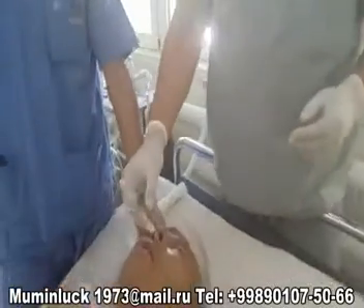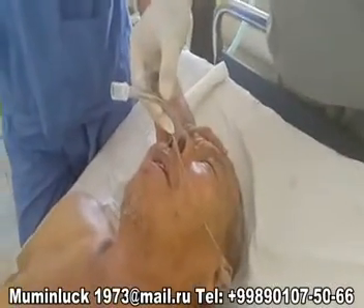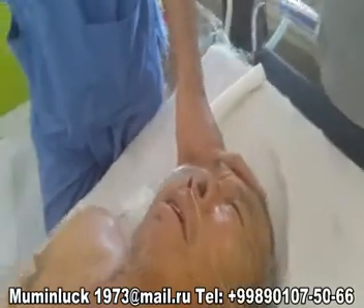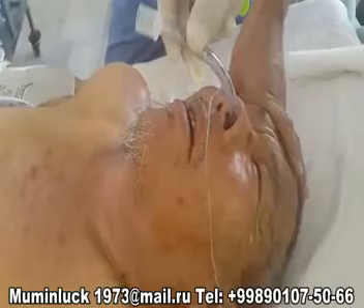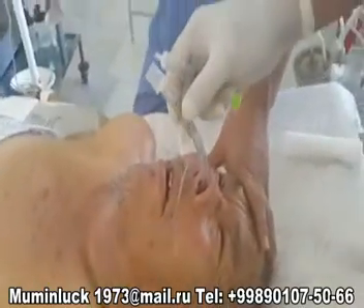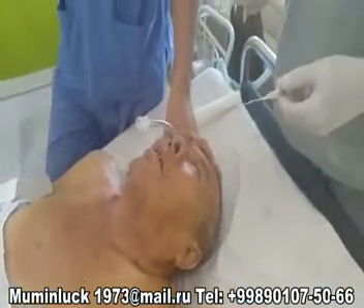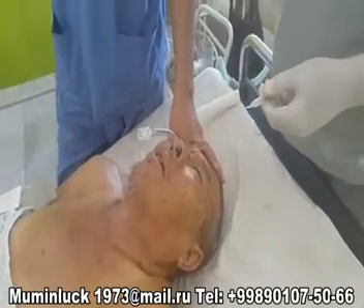To make the process of intubation less traumatic, we keep the tube in hot sterile normal saline. This causes the tube to become softer. However, one should be attentive to checking the temperature of the tube before the procedure to avoid burns to the tracheal mucosa.